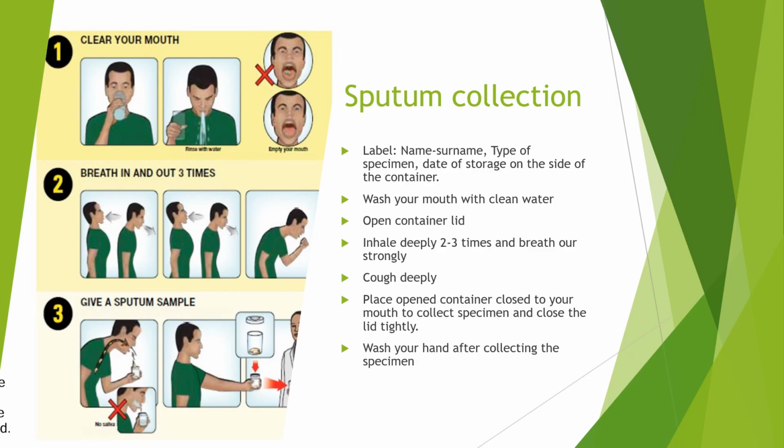At that time, you place the open container close to your mouth to collect the specimen, and please try to make that specimen, your sputum, go directly inside the specimen container and close the lid tightly. At the end, you wash your hands after collecting the specimen. After that, the sputum will be ready for the examination.